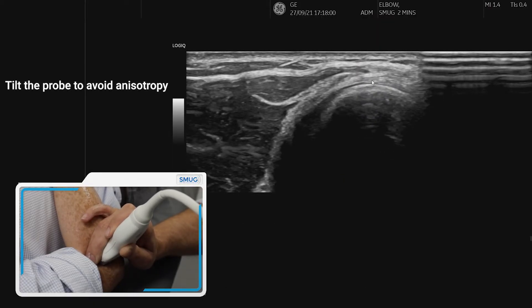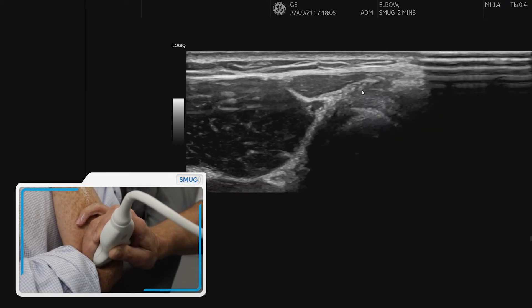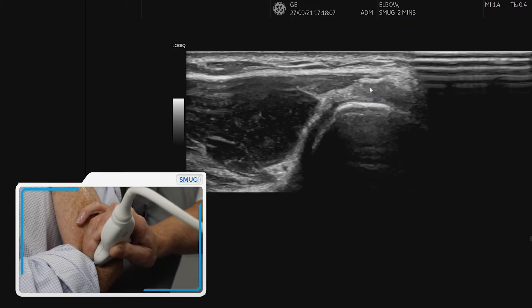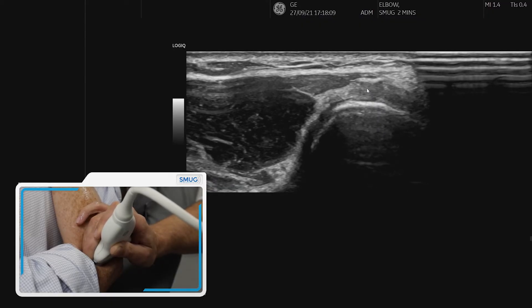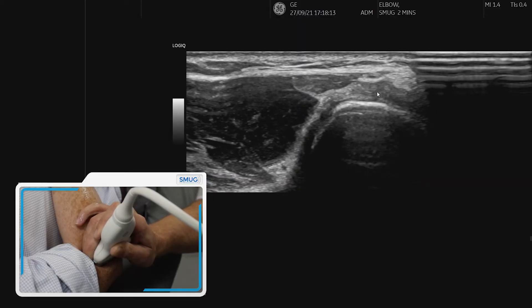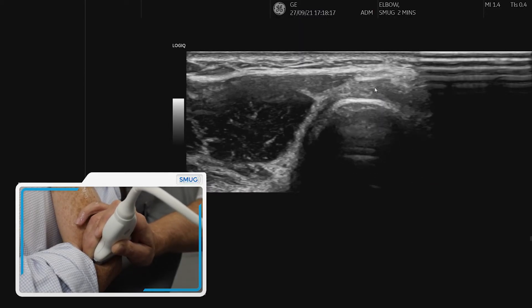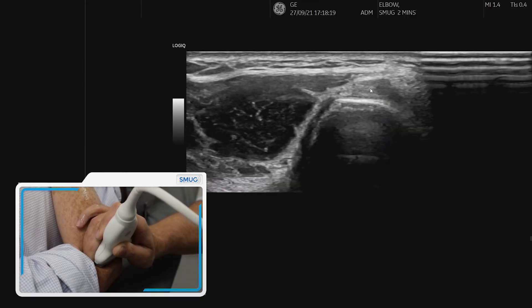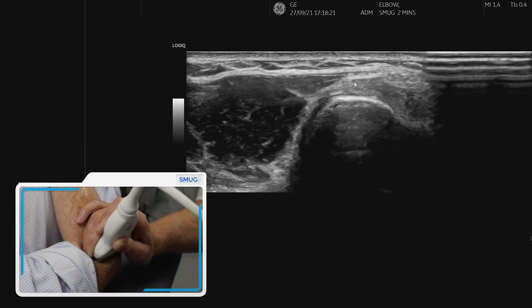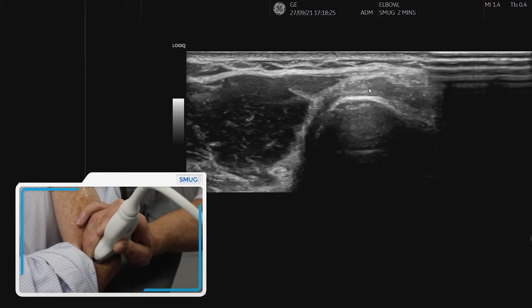You can see the annular ligament there — the long fibers of the annular ligament. And then as we come up, we can see specifically that attachment onto the lateral epicondyle. This is really where we need to look for any tendinopathic change or tears, and also where we need to assess on power Doppler for any neovascularization. That is specifically the ECRB tendon attachment onto the lateral epicondyle.